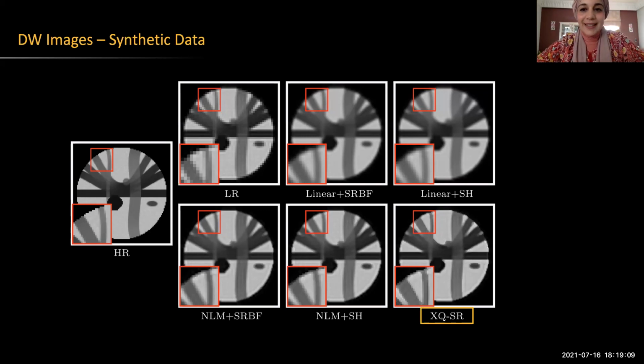Thank you. So basically you have already solved the problem, because once you have reconstructed or super resolved the data, you can easily apply any tractography algorithm to the data and get the tracks in the high resolution space, for example, and in the denoised data.